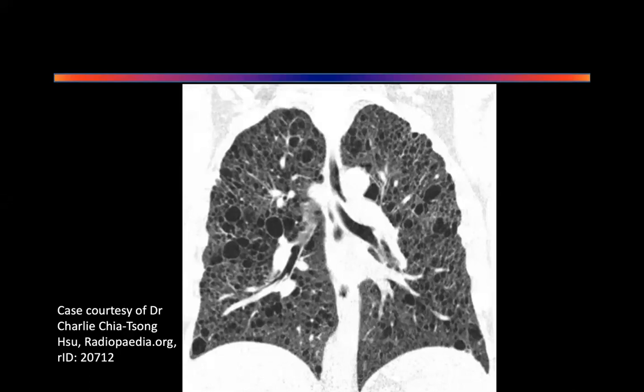Look at the CT scan, everybody. It's a honeycomb appearance. Multiple cysts present in all the lobes of the lung, bilaterally affecting both lungs, with loss of vascularity in the periphery and congestion in the center. The first thing going through my mind is a disease called lymphangiomyomatosis. Also think about other diagnoses like bronchiectasis or congenital cystic malformations within the lung.